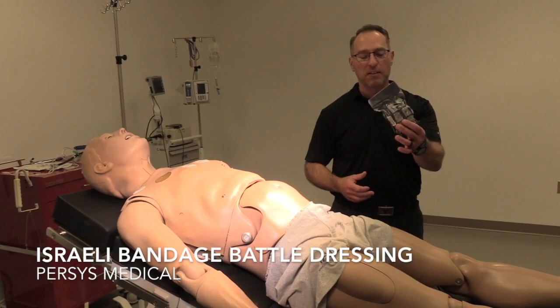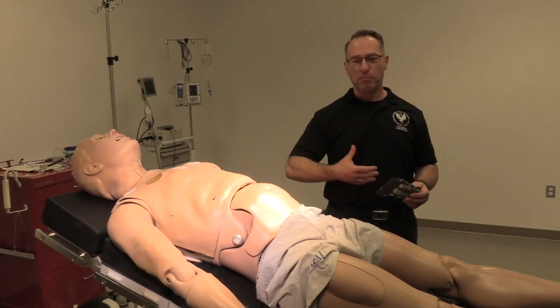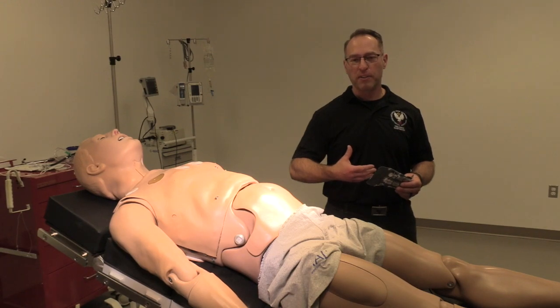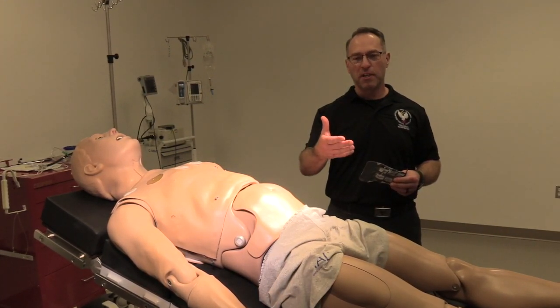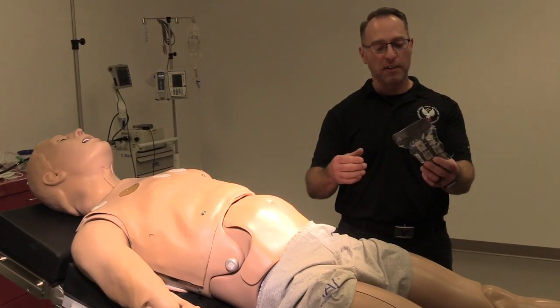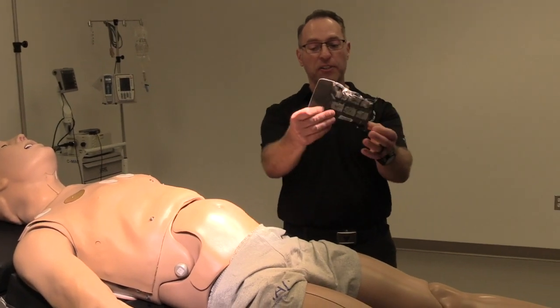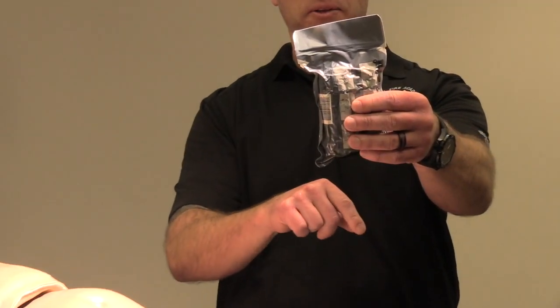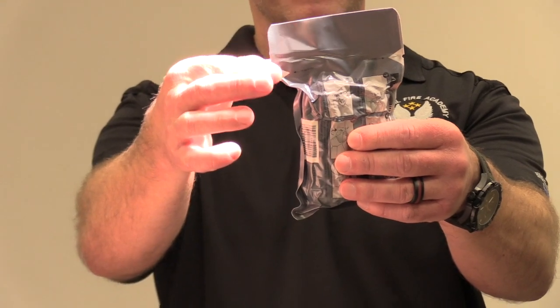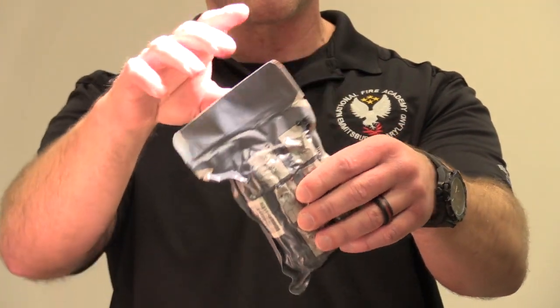All right, now we're going to talk about the Israeli bandages. This particular bandage is stocked in all of the ballistic vest kits that are on all the med units. So the initial teams that are going to be part of Rescue Task Force, this will be the bandage that's going to be part of the kit, and you're going to need to know how to use it. On this particular package, you see that there's only tear notches on one particular side of the bandage here. And again, I would recommend maybe putting a piece of medical tape close to that so it makes it easier to find under stress.